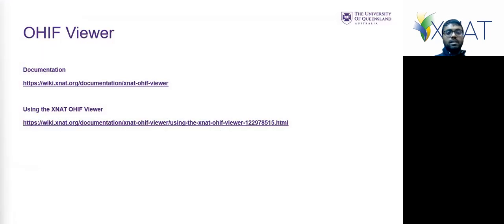This is the link to further documentation about OHIF and how to use it. So there's more information online, and that'll be the best place to have a look. I think I'll probably address this question.